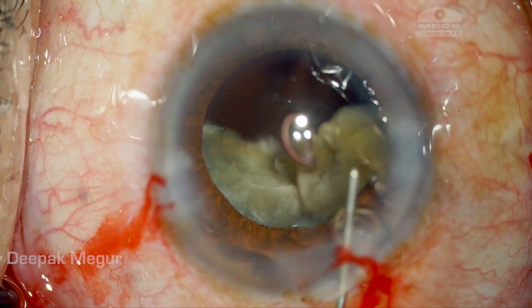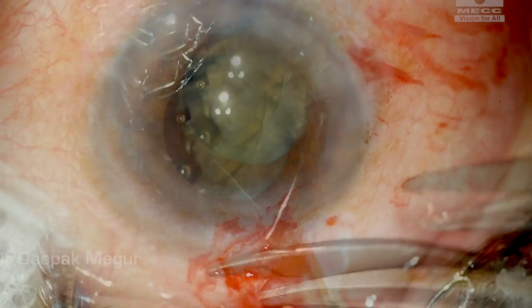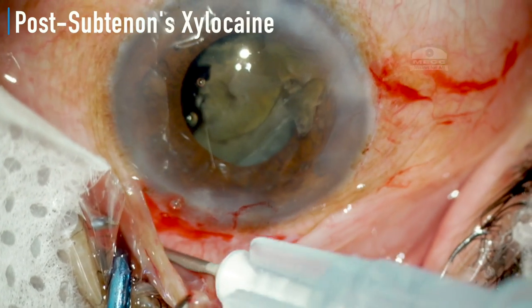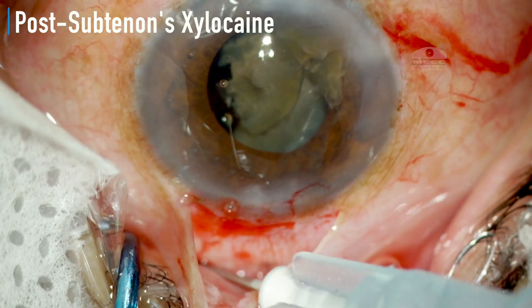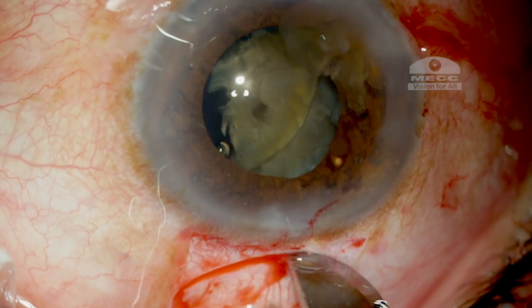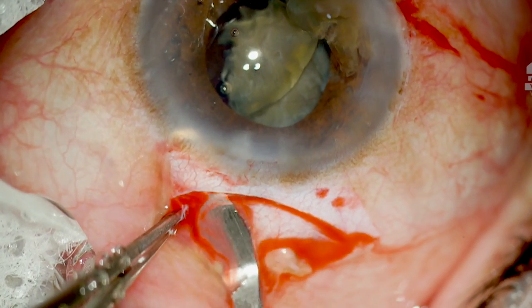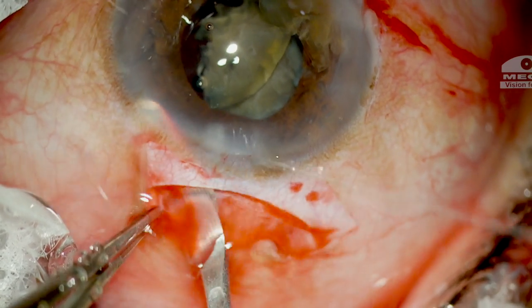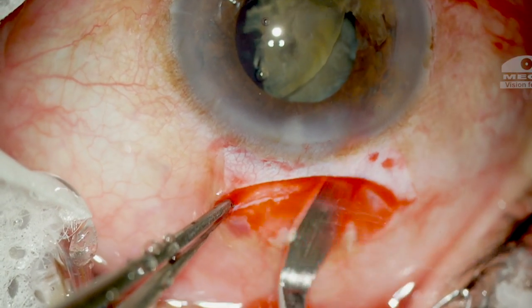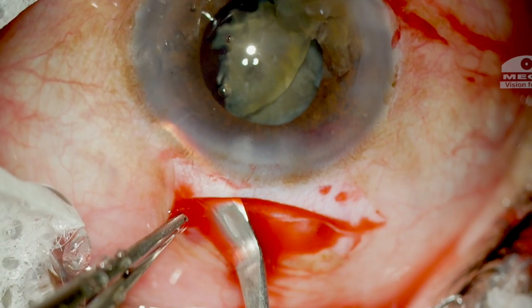I need to strategize my next move. After a momentary pause, I decide to convert to SICS by creating a superior sclerocorneal tunnel. I shift my position superiorly. Since this case was being done under topical anesthesia, I am supplementing it with a posterior sub-Tenon's block using a blunt cannula. I usually avoid cautery. My assistant is constantly irrigating to help me see better as I create the tunnel.